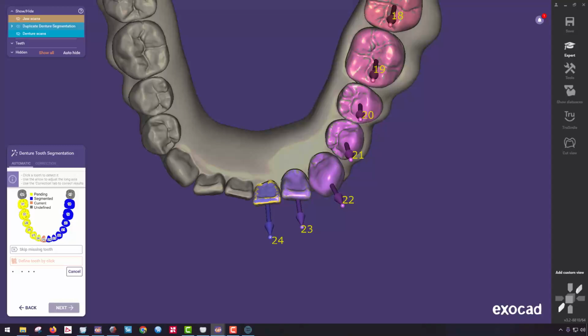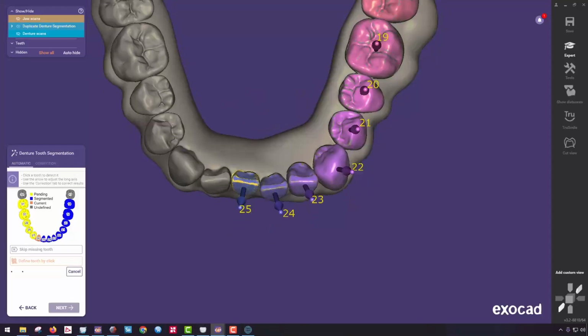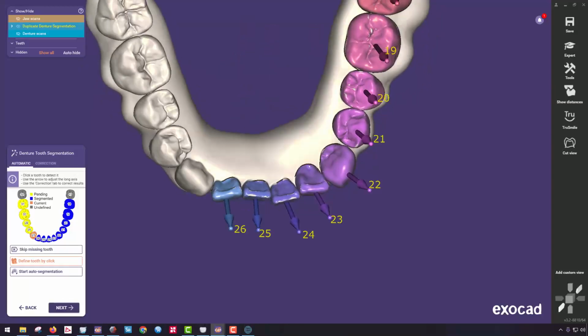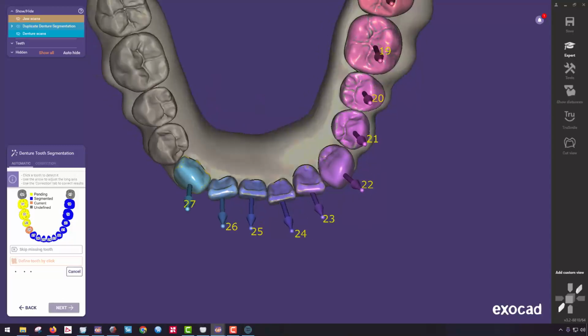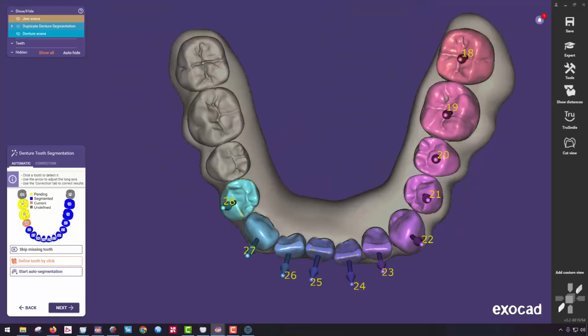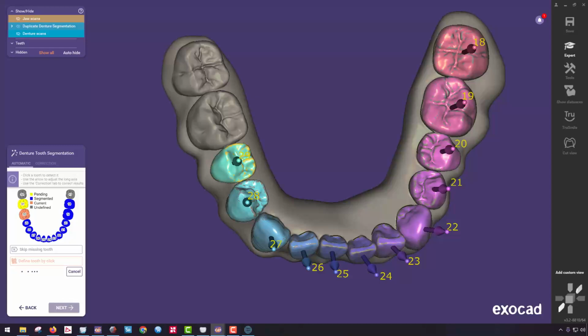Here's number 25. And I usually leave the path of insertion for exocad to calculate. So probably 8 to 9 times out of 10, defaults will usually take you most of the distance for this workflow. Finding the center right in there, finding the center right in here. Good. Finding the center.